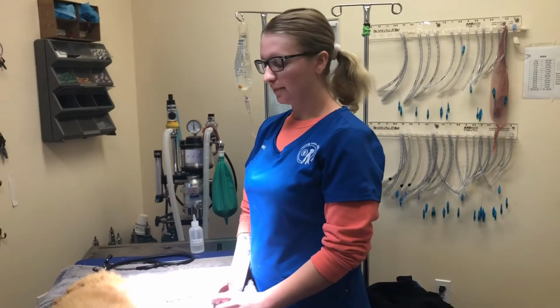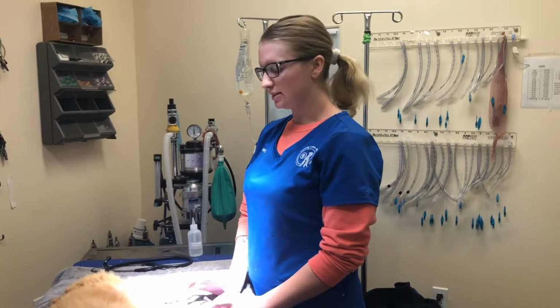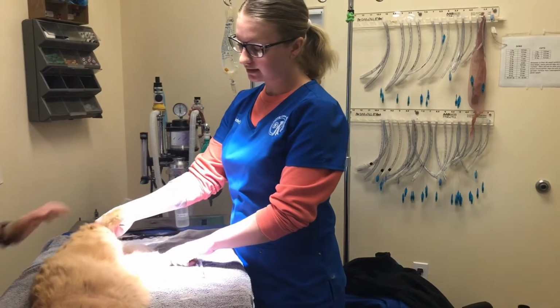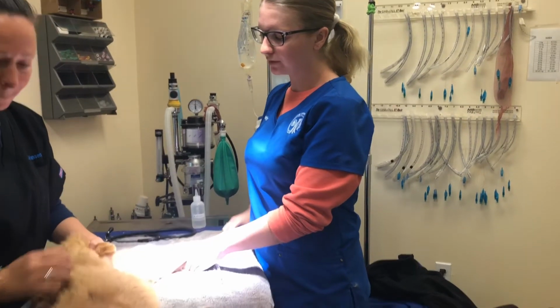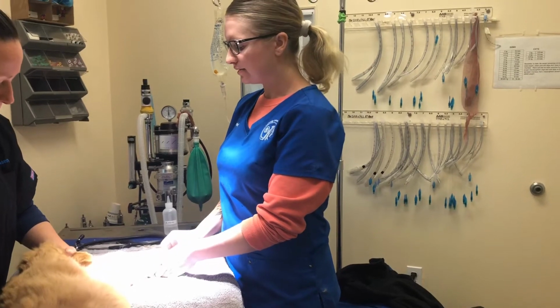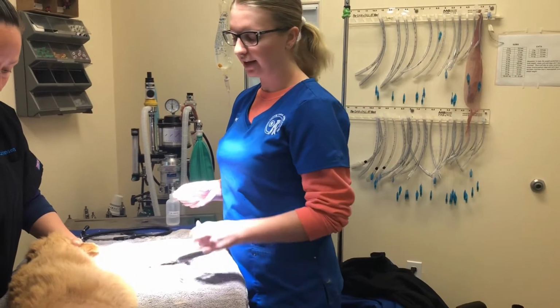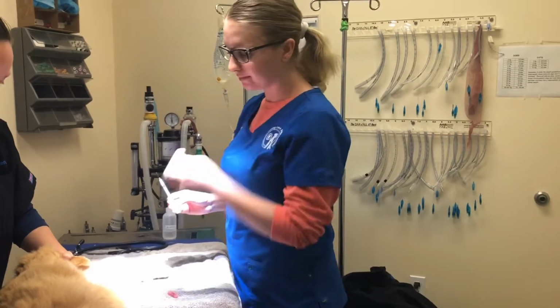Okay, now I'll be performing a blood draw from a medial saphenous vein on a feline patient. Our patient has been sedated for this procedure. The medial saphenous vein is located on the medial aspect of both rear legs, so it runs down the middle here. I'll have my restrainer occlude the vein for me and hold the up leg out of the way. And then I will go in with some alcohol to help me visualize the vein better and kind of sterilize the area. I'm going in with a 1 cc syringe and a 25 gauge needle.